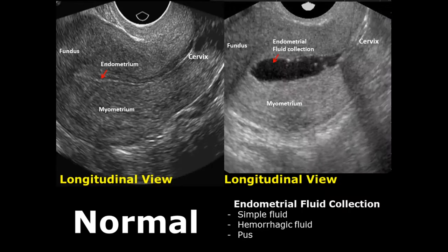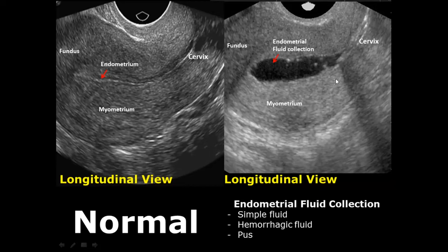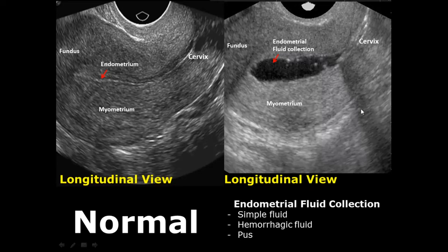Endometrial fluid collections can result from a variety of causes and come in three types. First is simple fluid, which is completely anechoic — black in appearance. Second is hemorrhagic fluid, which has internal echoes due to clotted blood and blood products. Third is pus collection due to infections, which also shows internal echoes and septations, giving a heterogeneous fluid collection.